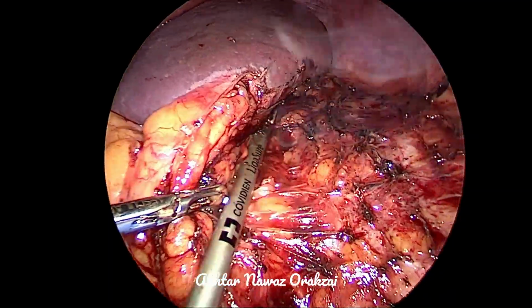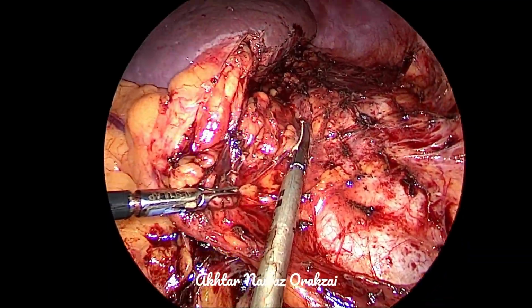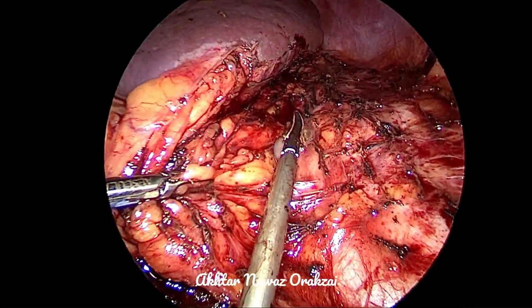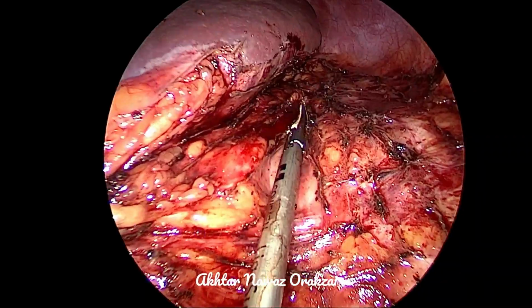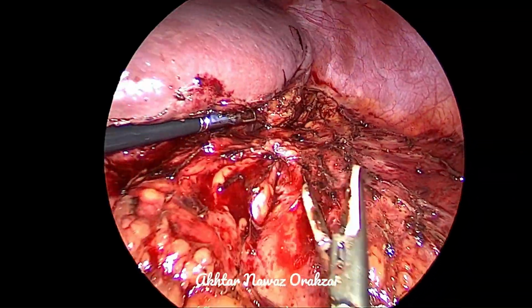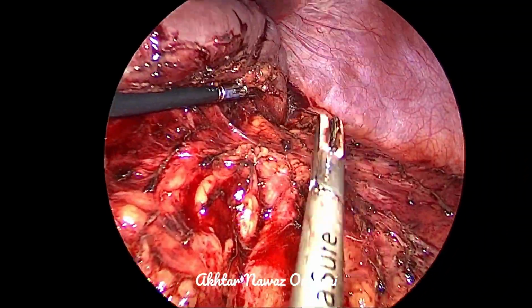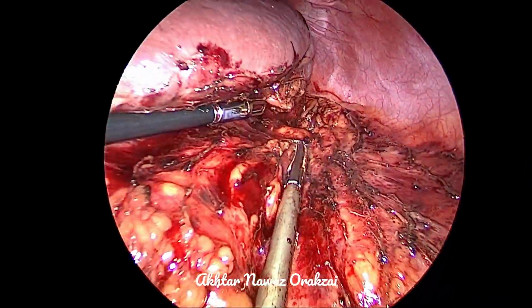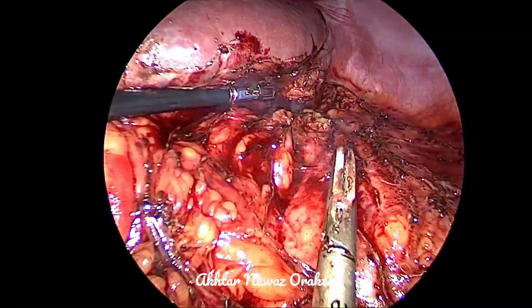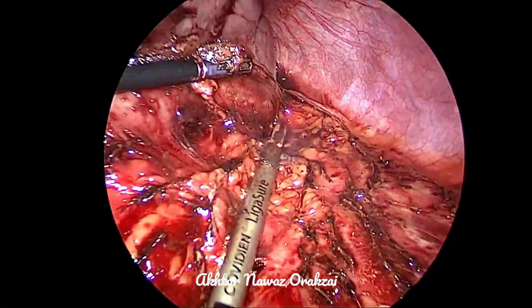Number one is the injury of the diaphragm. So if you go too far away from the kidney, you can open up the diaphragm, and if you try to stay away from the diaphragm, then there are chances that the splenic hilum, especially the splenic vein and the splenic artery, may be injured, and that may lead to a serious complication, which can end up in splenectomy.